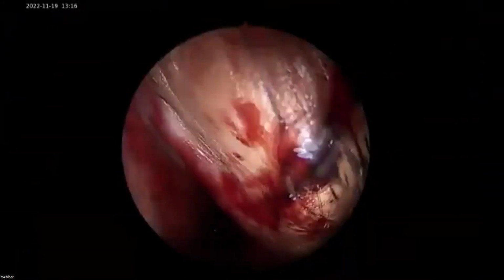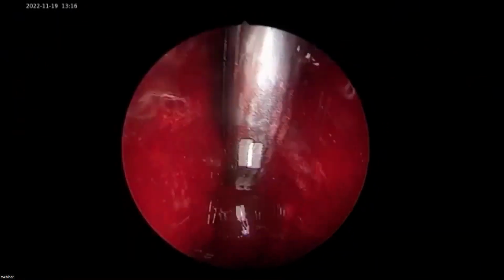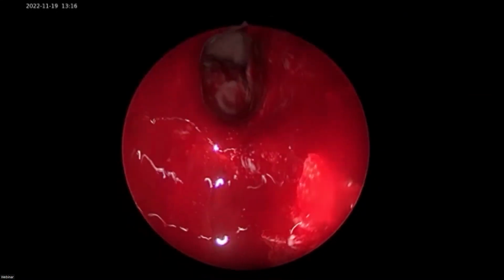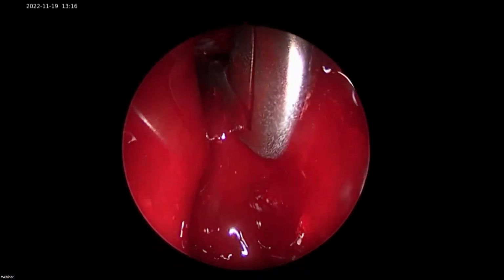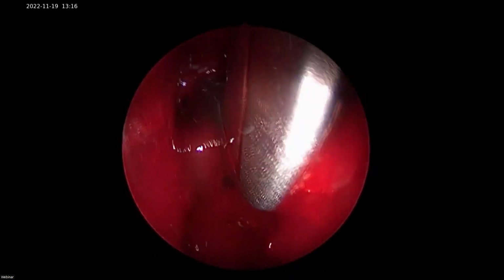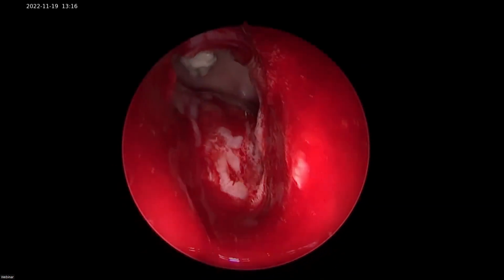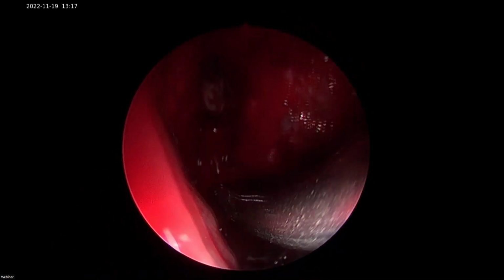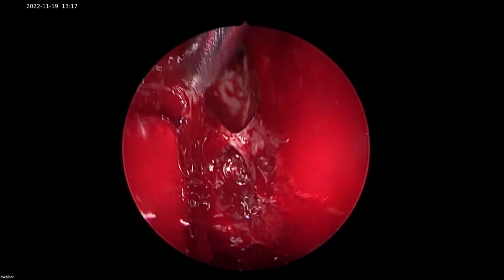since 15 years. He's been operated on the left ear, stapedotomy with piston fixation in May 22 at BDBA, and there's improvement in the symptoms. His tuning fork test shows Rinne bilaterally negative and Weber's to right. This is his PTA, which shows right moderately severe conductive hearing loss and left mild to moderately severe conductive hearing loss. Impedance audiometry shows right A type and left As type of curve with bilaterally absent reflexes. HRCT temporal bone of right side is normal, whereas left side has post-stapedotomy status. Ma'am will take us through the radiological findings and the procedure.